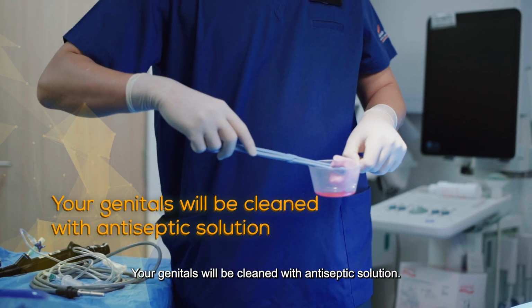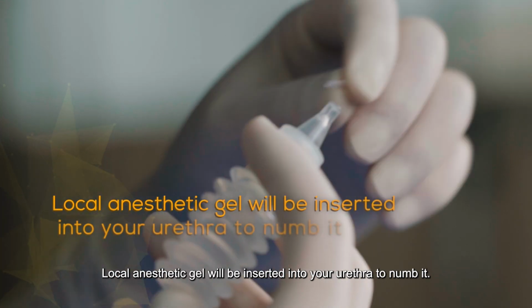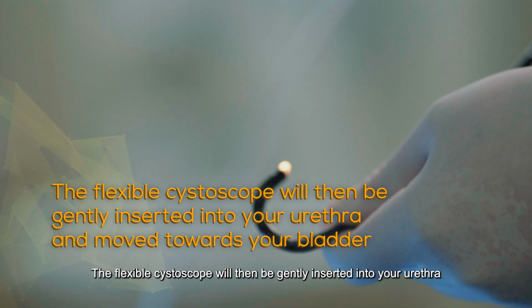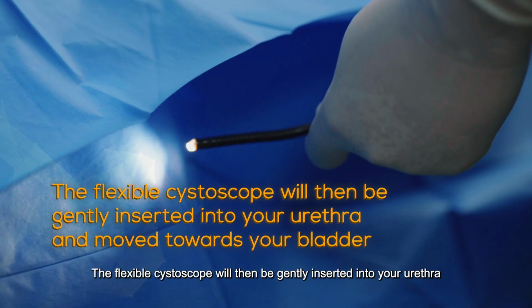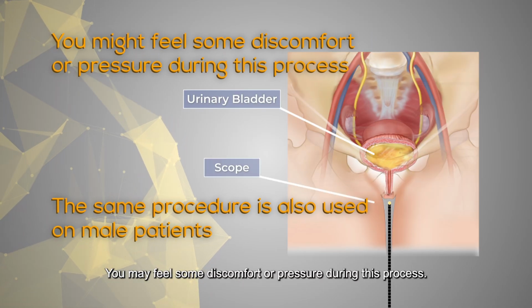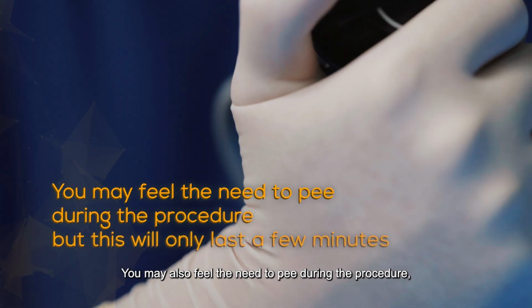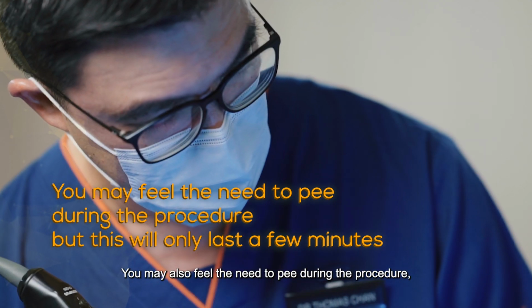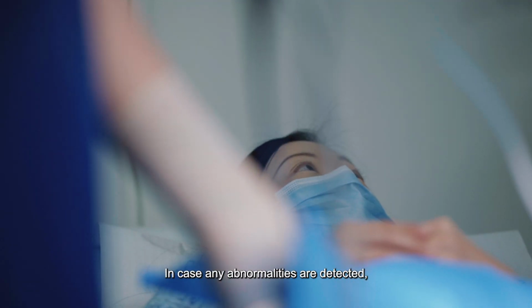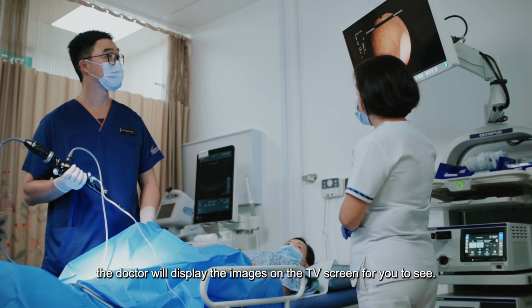Your genitals will be cleaned with antiseptic solution. Local anesthetic gel will be inserted into your urethra to numb it. The flexible cystoscope will then be gently inserted into your urethra and move towards your bladder. You may feel some discomfort or pressure during this process. You may also feel the need to pee during the procedure, but this will only last a few minutes. In case any abnormalities are detected, the doctor will display the images on a TV screen for you to see.